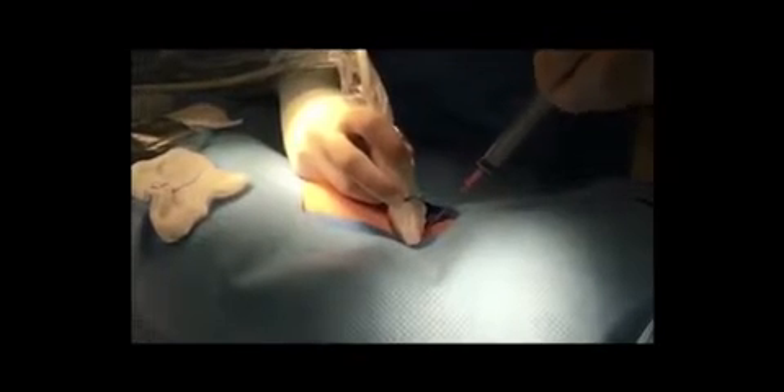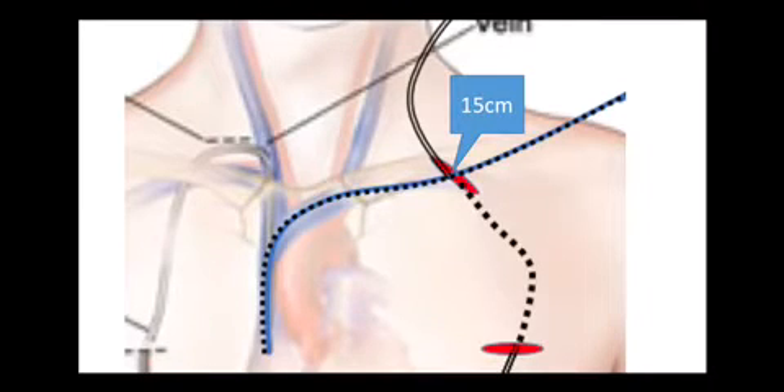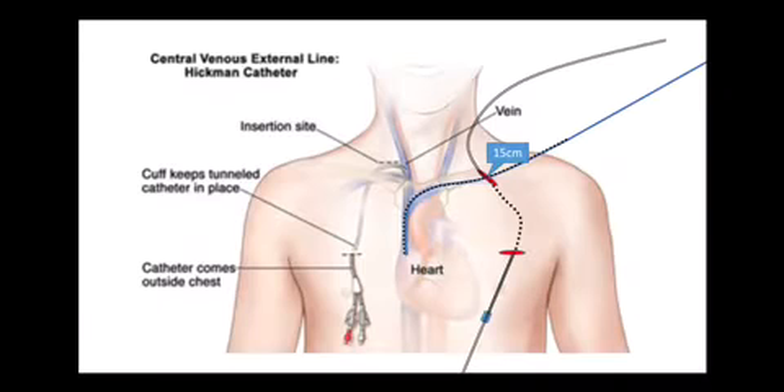The vein is accessed and the wire is inserted into the vein. The basic idea of this trick is that the wire is used not just as a guide for the catheter, but actually as a measuring device. The tip of the wire is placed exactly where we would want the tip of the catheter, and then the distance is measured from the tip of the wire to where it exits from the skin. That distance is then used to know how long to cut the catheter.